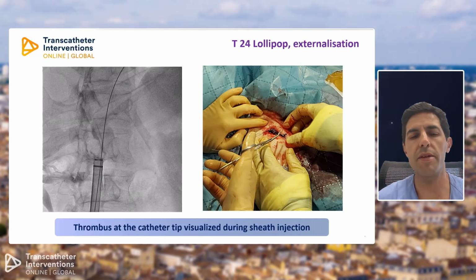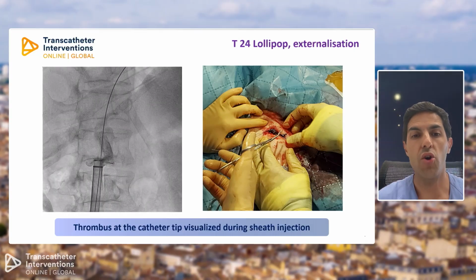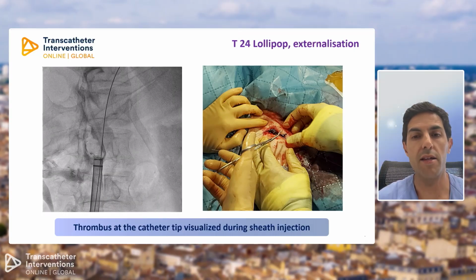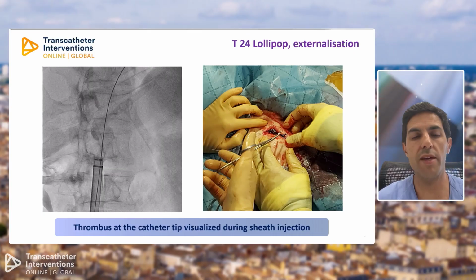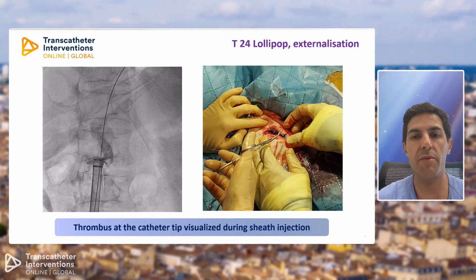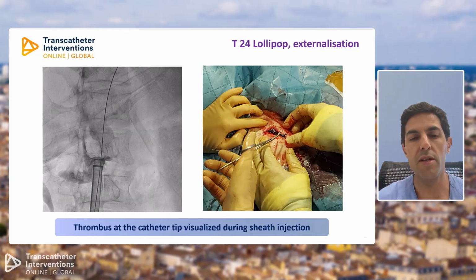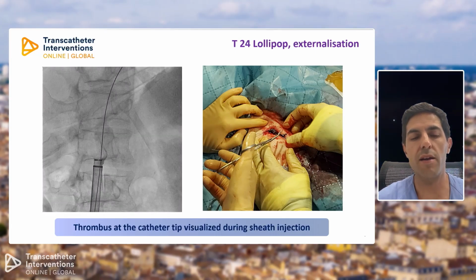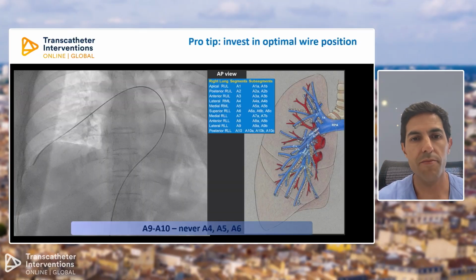It happens, maybe it's 10% of the cases or 20% of the cases. It depends on the amount of thrombi that you can find in the lungs. And also it relates to the age of the thrombi. So the thrombi that is very well organized, maybe a DVT that has been in the leg for maybe 10 days, 2 weeks, it's going to be hard and very difficult to elongate and get into the catheter.